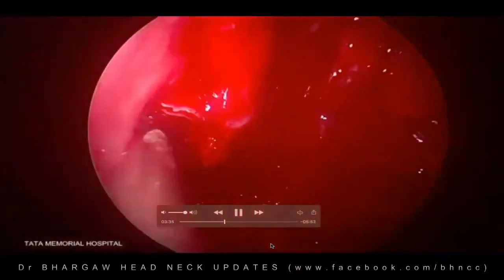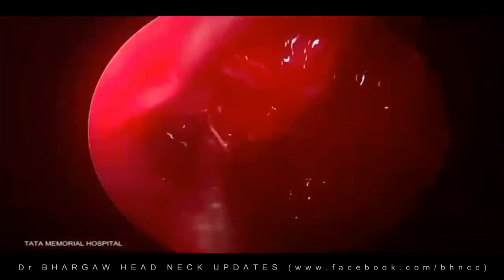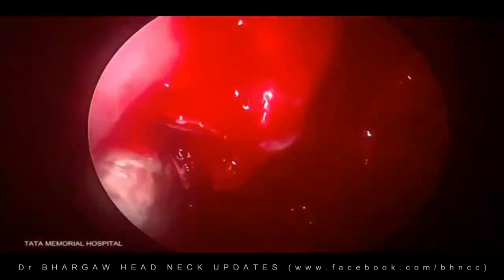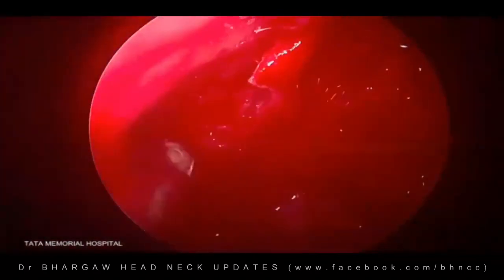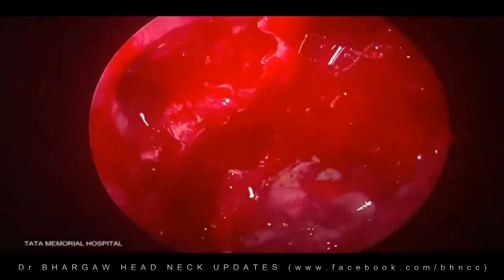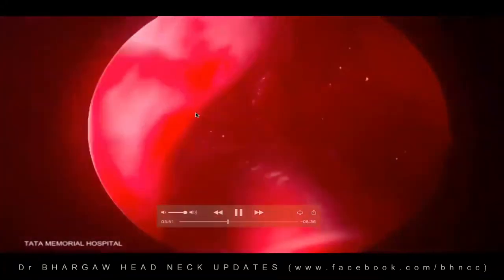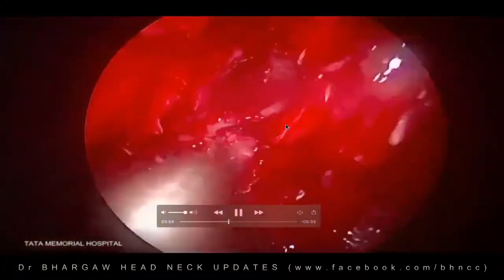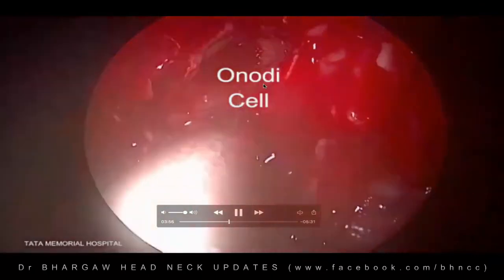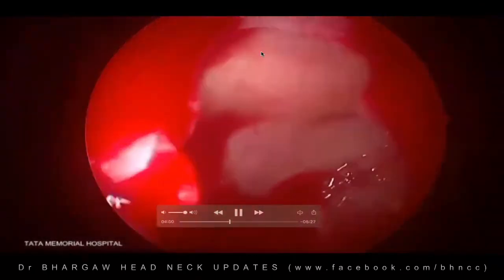Then we are doing an uncinectomy and antrostomy on the side of the disease and clearing the disease as much as possible here. We are doing an ethmoidectomy here with the debrider and just clearing the disease off it. Most of the disease was on the, so that's the Onodi cell that's just seen superiorly. That's the sphenoid sinus that just opened up. That was superior to the sphenoid sinus.